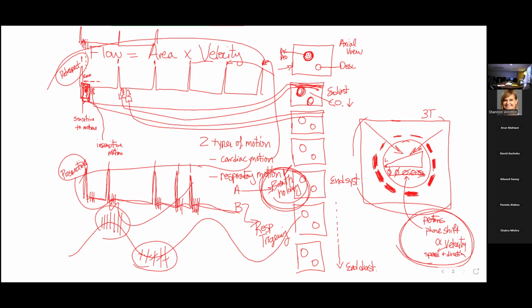Okay. So now that is going to take a long time, right? Because let's say we're doing end expiration, you collect these points in time. And then when the diaphragm starts to move or the bellows starts to change, you throw this away. And you don't start collecting again until you get back to this nadir when the heart is in the same position. So when we're using respiratory triggering, those are not going to be 8-second scans, right?